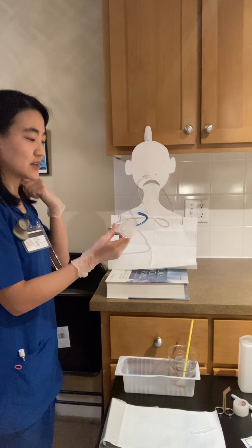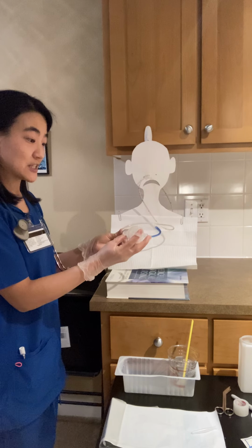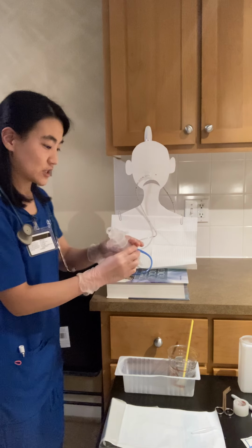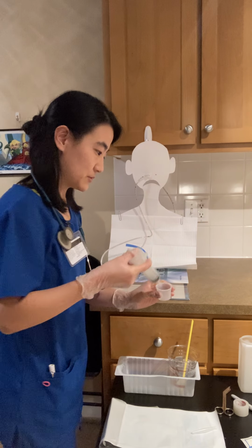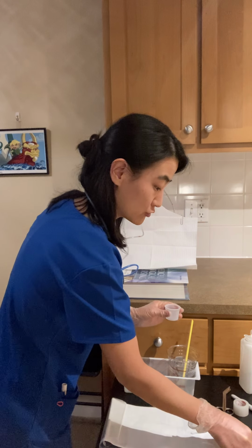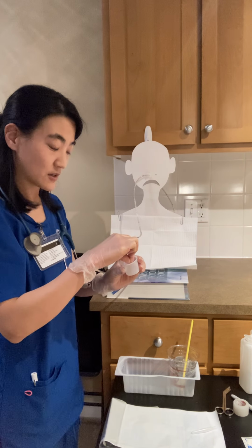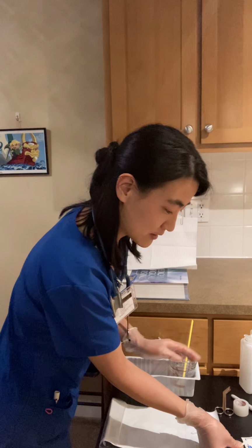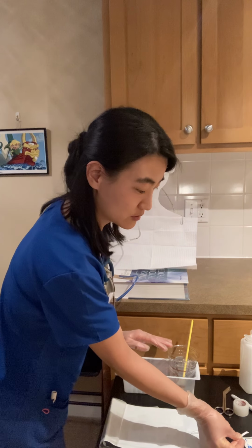And next I am also going to assess placement by aspirating some of the gastric contents, which I will put into a cup. And using a pH strip, I'm going to check what the pH of the gastric contents is, and I'm going to make sure that the pH is showing as 5 or below.